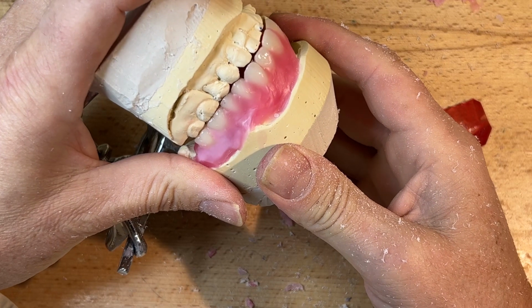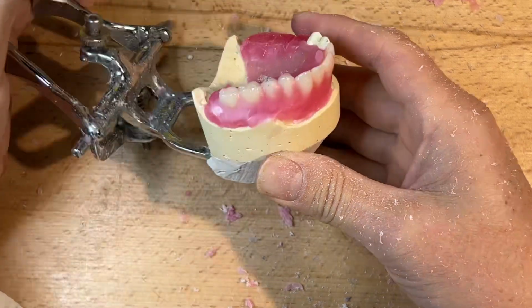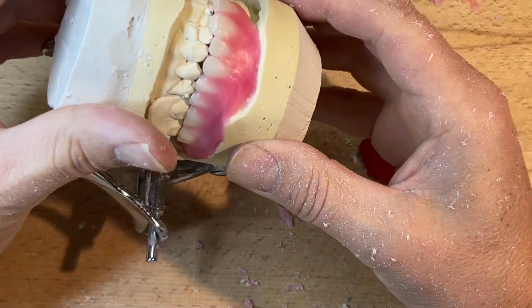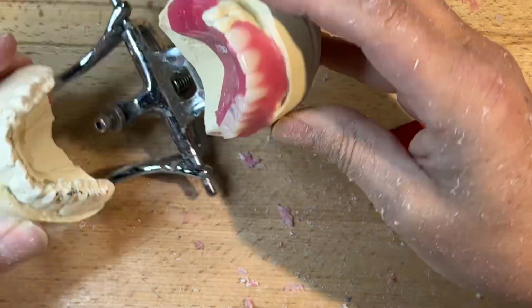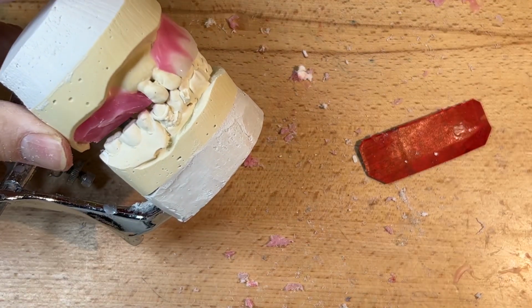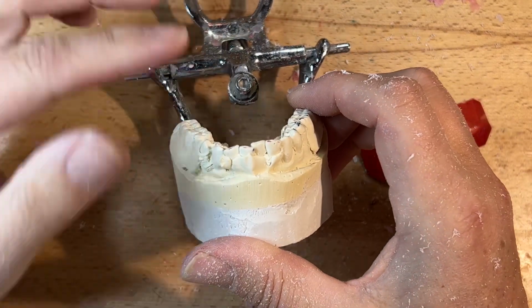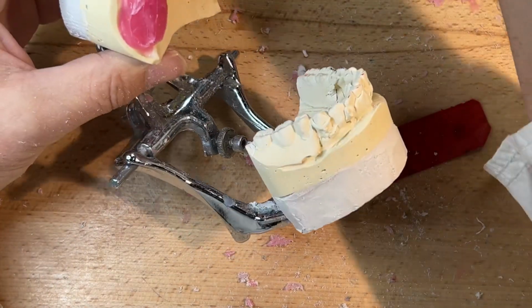So I'll probably do a little bit more on number 5 at the end. If I can just, it's still soft though. I'm looking here that I've got some premature contact on number 5. You see I've marked here with a blue pencil. Kind of exaggerated the excursion here. Yeah, take a little bit out after I'm done. Let's move over to this side and continue on with, you can see this occlusal height is a little bit higher on the posterior. It's going to be a little challenge. Let's see what it turns out.